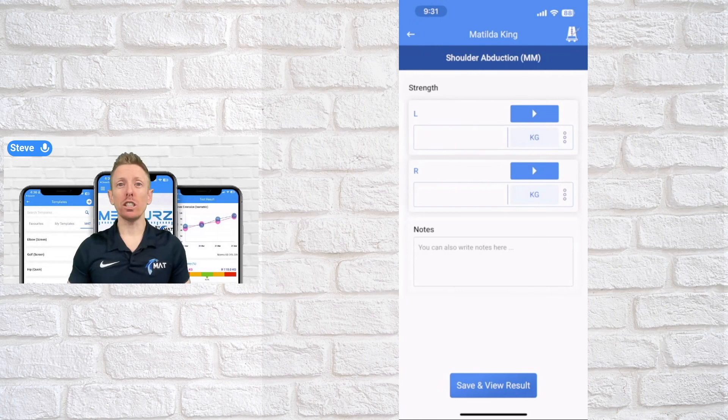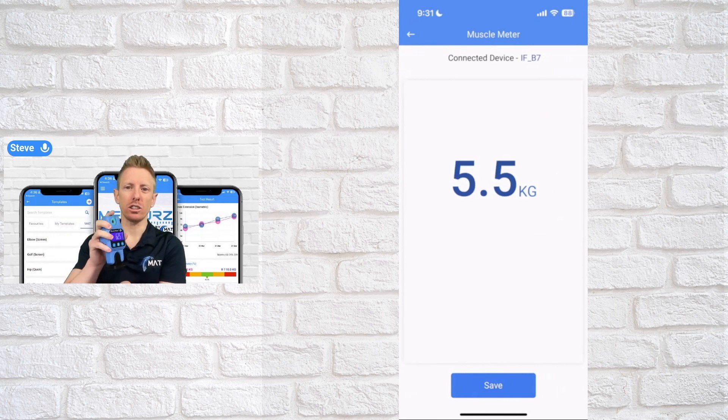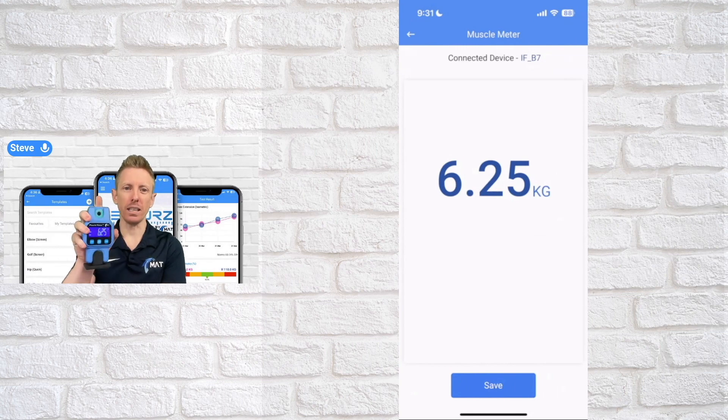Once you've already paired your muscle meter, subsequent times you open the app you just hit the play button, make sure your device is on, and it'll automatically connect. Just make sure it's tared and you'll see straight away that as soon as your device turns on it automatically pairs and you get the data. It's the simplest process for any device like this on the market to connect and get meaningful data.